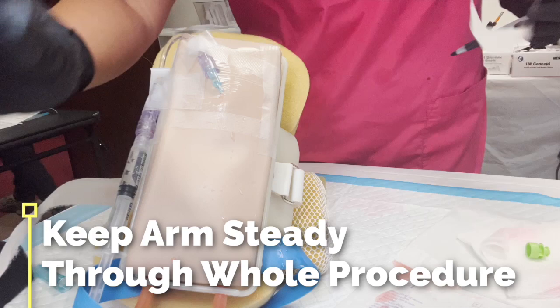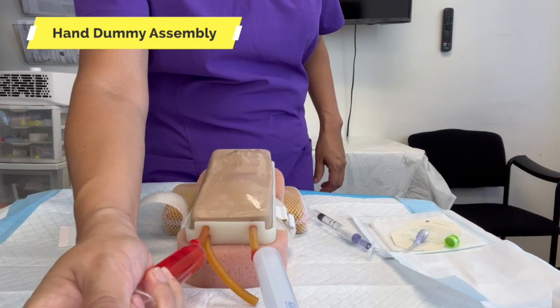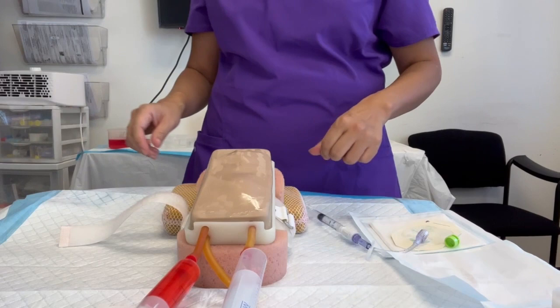Then it's time for the label — what do we put on the label? We're gonna prepare the blood by pushing a little bit in, then aspirating a little bit out on the other side. You should have a little bit coming out — there, you see that?